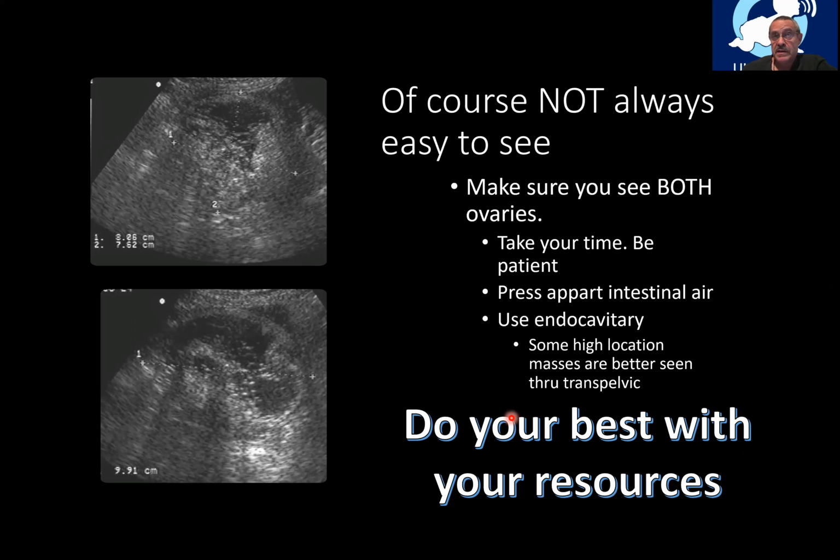of course, if we don't have a good context, it's not that easy to see. You know that patients are sometimes overweight and full of intestinal gas, and we don't have this vaginal transducer, and we have to take a look at the pelvis with whatever we have.